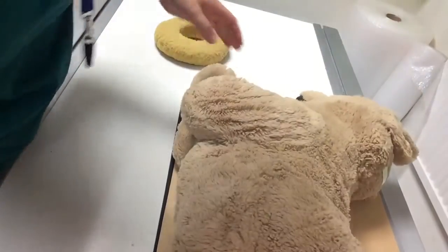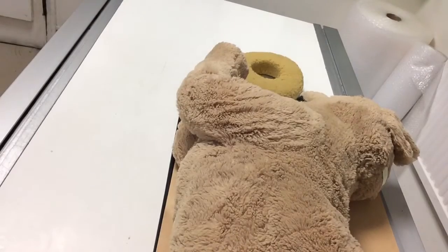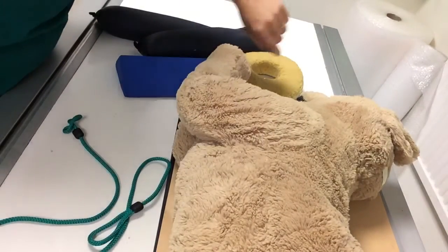Hi everyone. The light's on and it's going to stay on for this video because I just wanted to go through with you what to use for your equipment — because you're going to have sandbags, you're going to have wedgies, you're going to have ties, and you're going to have tape — and what should you do with these? Because this patient, he isn't big, he isn't heavy.